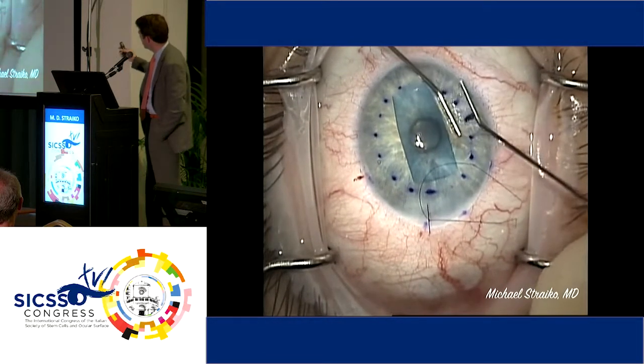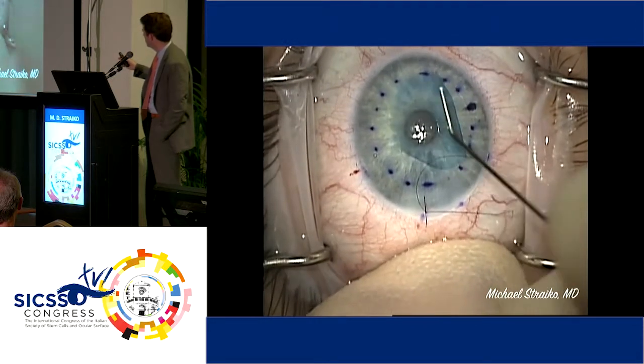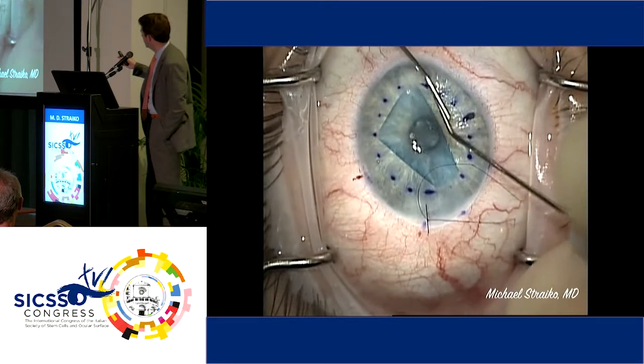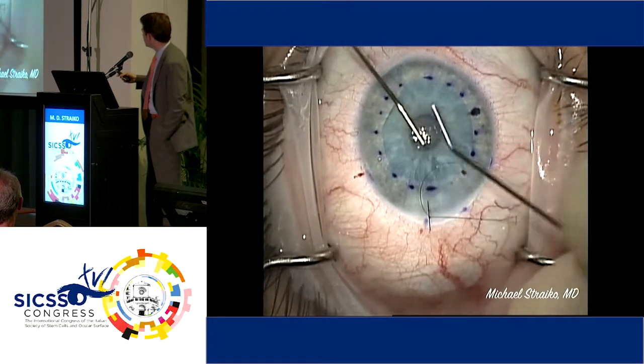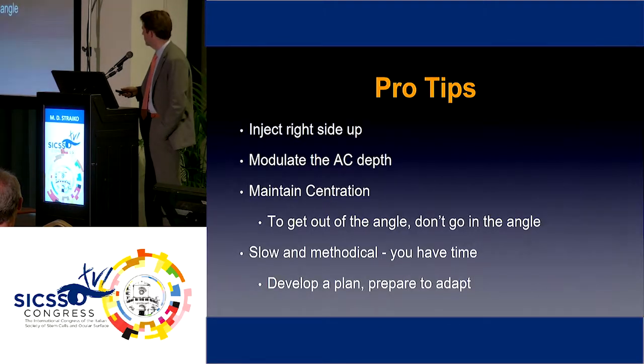So tapping, it was just going forward, backward. With 2 cannulas, I'm able to walk the graft into position. I'm going to stop there because it was going to open into the angle, and so I'll recenter it before I open it. It's just as important to be centered as it is to be open. And now we just lock that in place with some gas.